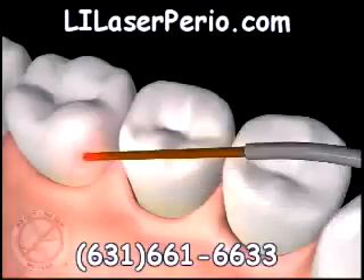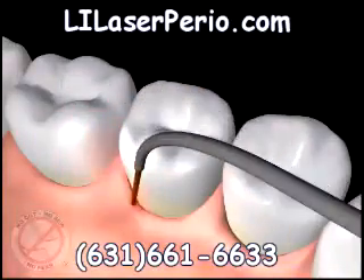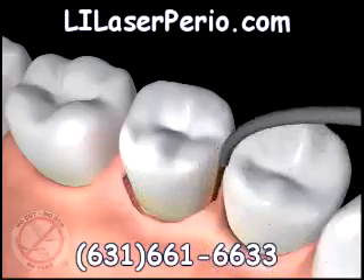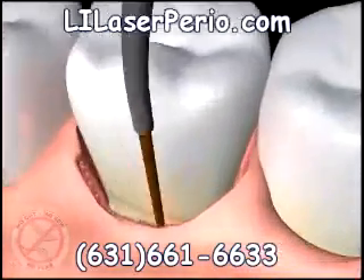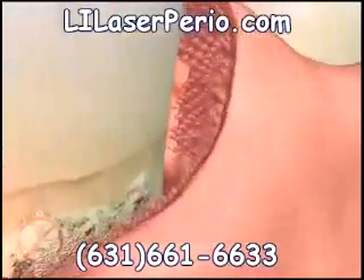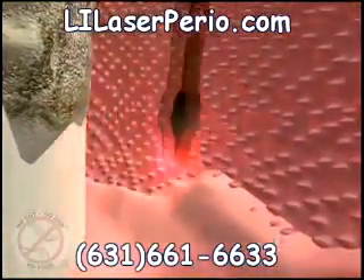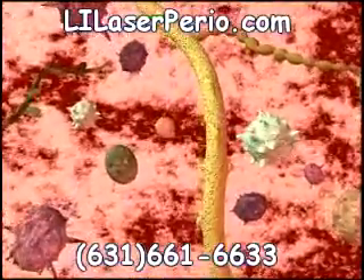The fiber optic tip is gently placed at the top of the periodontal pocket to begin removal of diseased tissue that lines the pocket. This is where bacteria live and build a neighborhood of its own that destroys healthy gum tissue and bone that holds your teeth in their proper position. There are specific germs and bacteria that cause gum disease. The Periolase laser is designed to target and eliminate selectively only the diseased tissue and germs, dissolving toxins and leaving the healthy tissue unharmed.